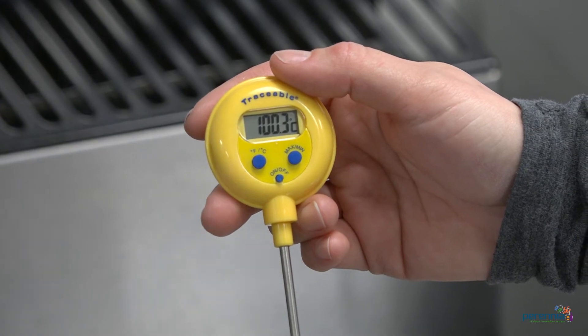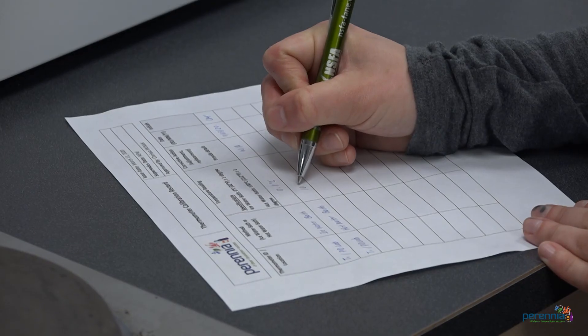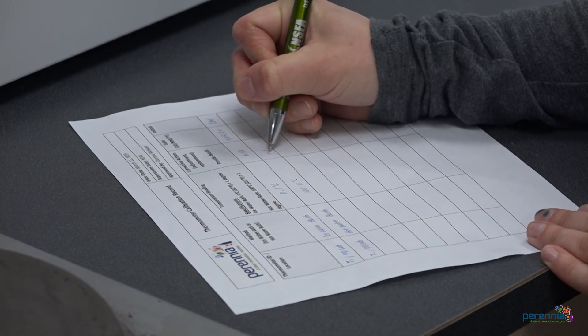Note that the boiling point of water will vary with altitude. If the reading is not accurate, adjust the thermometer until it reads 100 degrees Celsius plus or minus one degree. Recheck to ensure the thermometer is reading 100 degrees Celsius. If it cannot be calibrated, replace it with a thermometer that can. Record the results on a calibration record, including if any corrective action such as an adjustment or replacement was required.